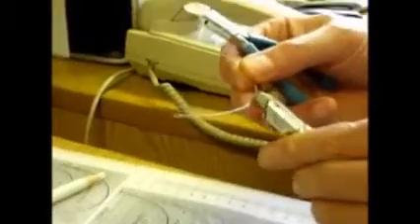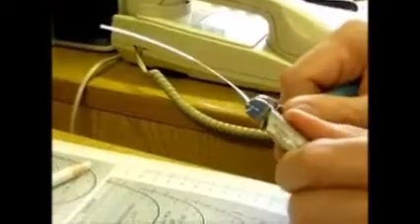So the 1925 steel, I suppose you could use any rectangular steel to do this sort of thing. Well, I suppose in the mouth you might do it with a TMA, but in fact when we got postgrads to do the wire test with TMA, they made an awful mess of it. So we decided to keep it as the steel.